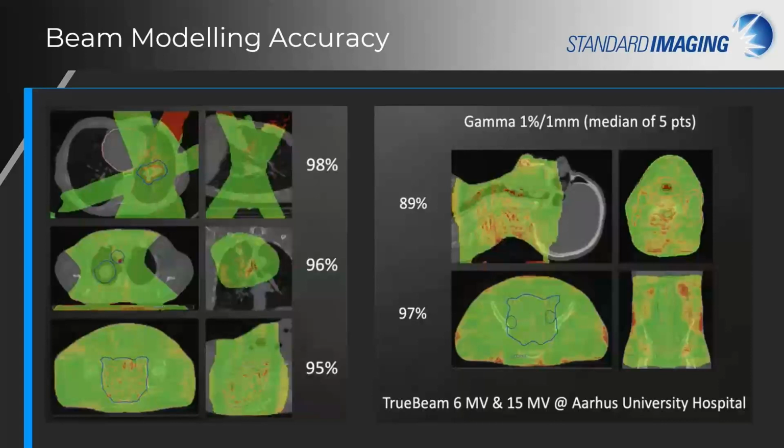Customers using IMSure 3D are confident that the dose calculations are just as accurate or more than their treatment planning system. So any differences are investigated thoroughly and may even uncover issues with their treatment planning system model or a breakdown of the treatment planning system algorithm with a particular patient or plan.